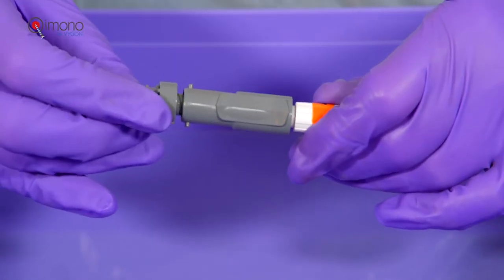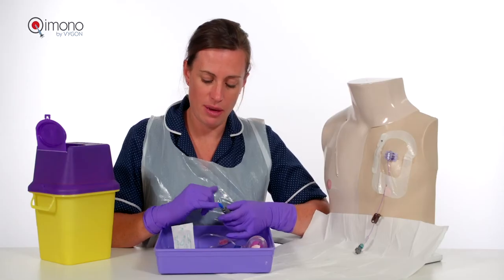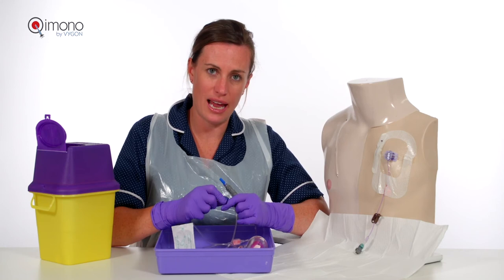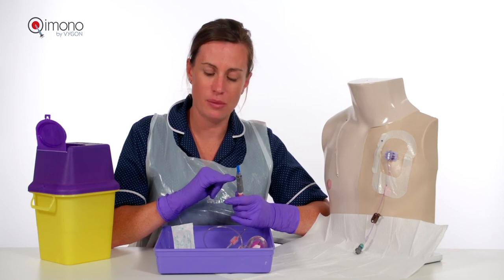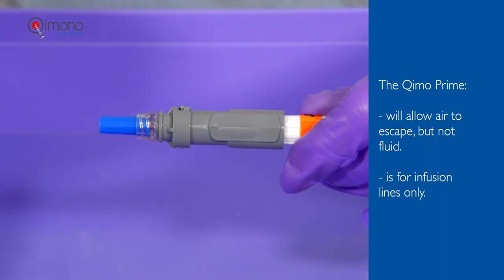The Qimo Prime is then inserted onto the end of the Qimo Male and we wait for 5 seconds with it unclamped, in order for the dead space in the male to be removed: 1, 2, 3, 4, 5.